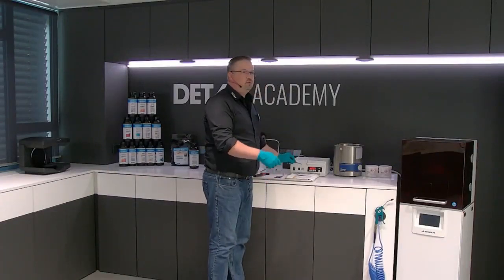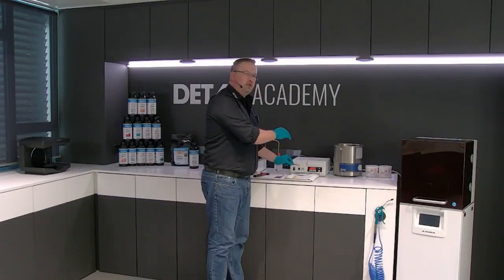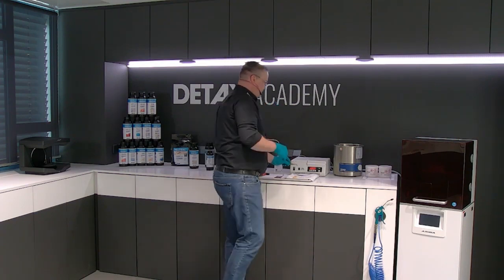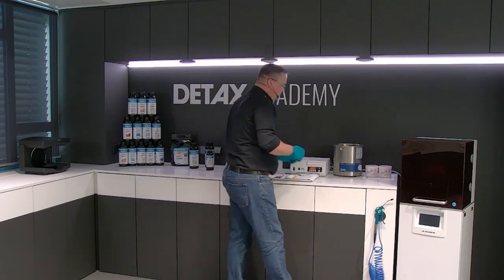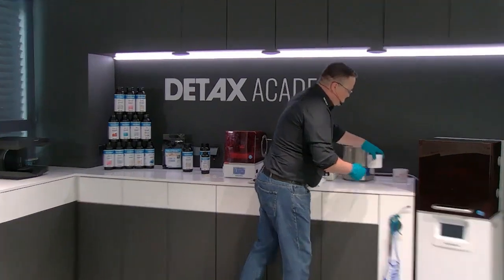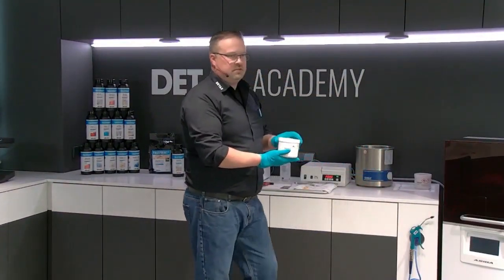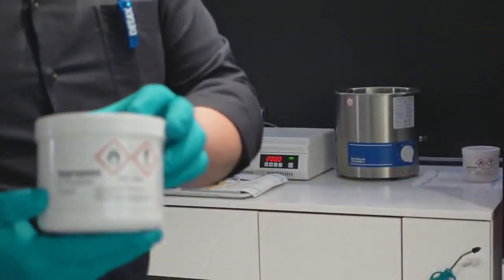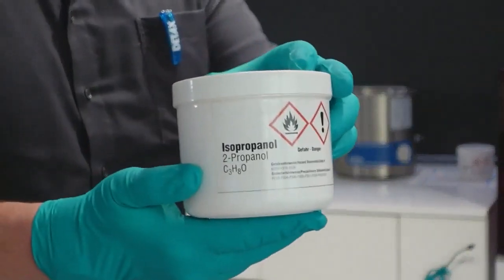The best is for you to prepare a small box, a small case. If you blow some material away, it will be inside the wall, inside the box. We use boxes with isopropanol alcohol. I will show you this in detail. I hope you can see it here.